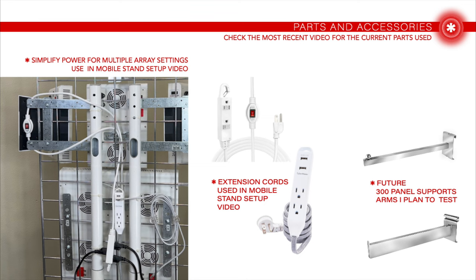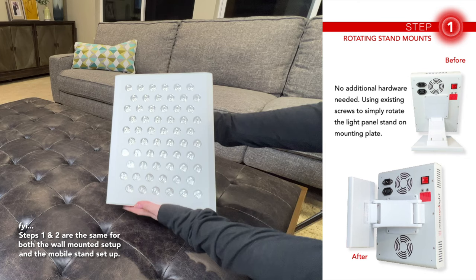You'll also see here some support arms I'm going to be testing in the future. If you've already seen the mobile stand video, you'll probably want to skip right to step three.